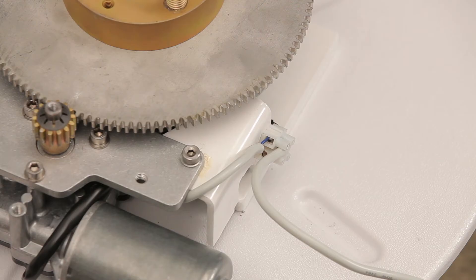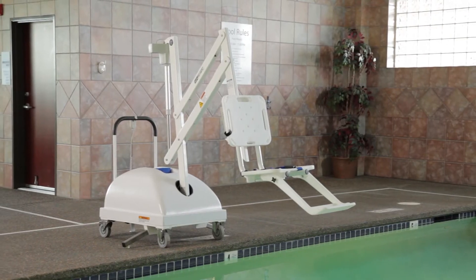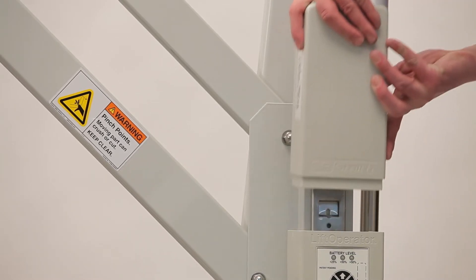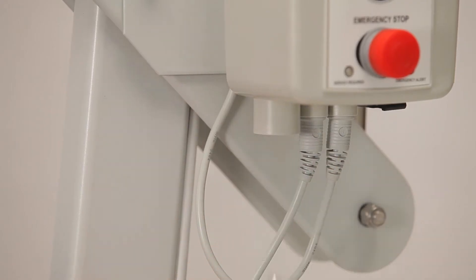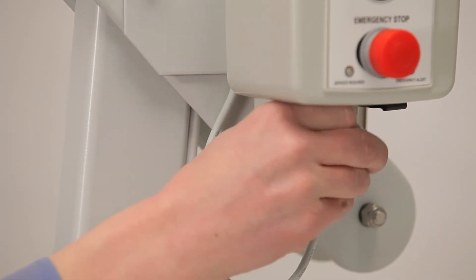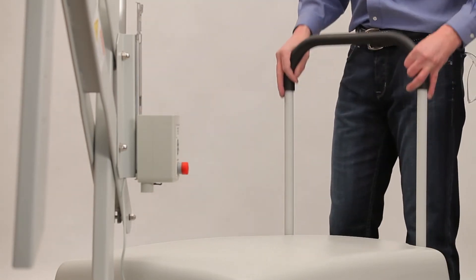If you need to replace the motor assembly, gears, motor cable, or the tension spring, you will need to disassemble the lift to gain access to these components. To access the motor and the gears, first remove the battery, then unplug all cables from the control box, including the hand control.